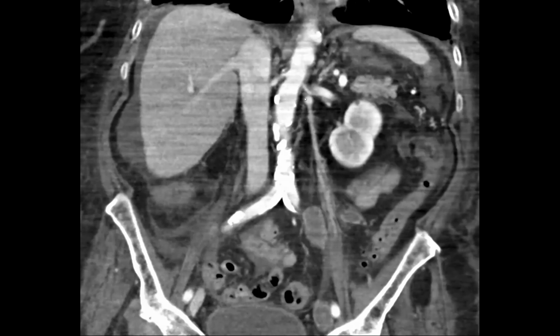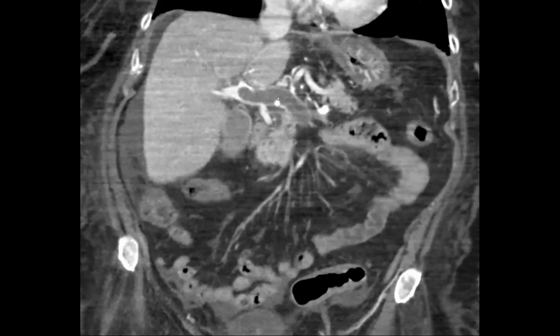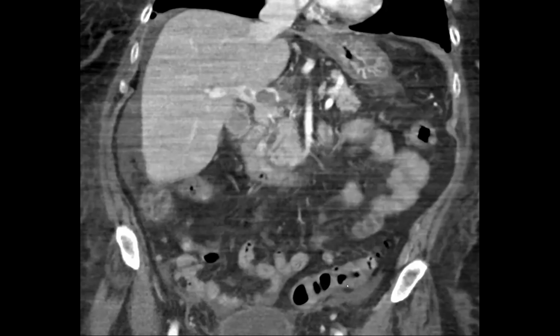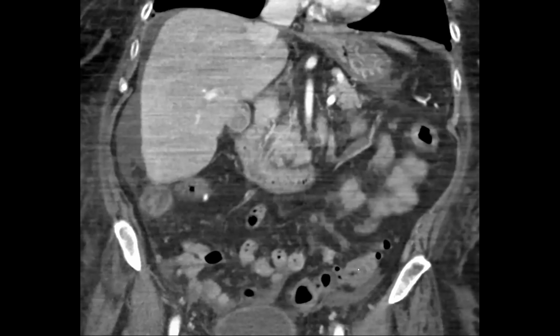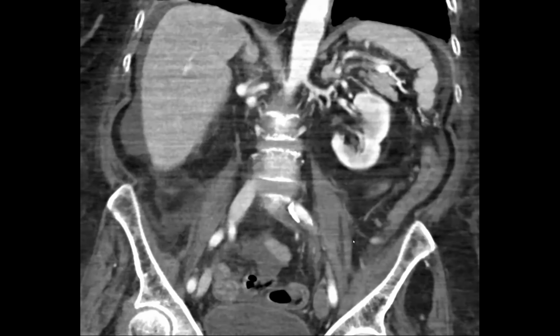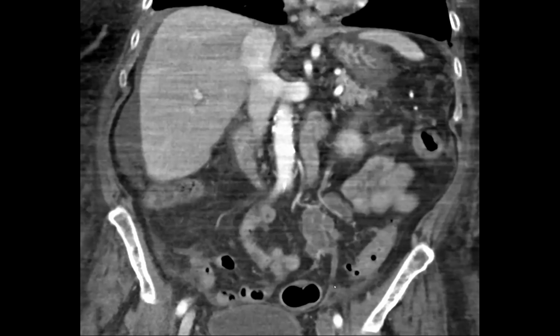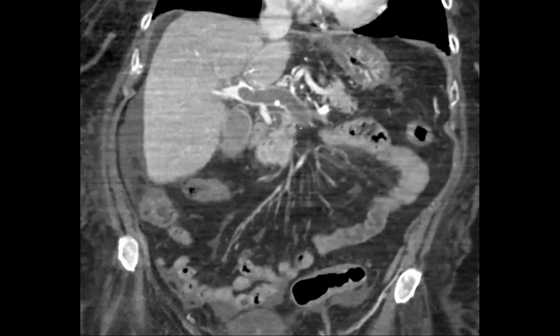That's also extending up into the main portal vein pretty extensively, and likely from an episode of diverticulitis. That's usually where these come from. You can see there are lots of diverticula here. We can't really see an acute diverticulitis right now, but it could have been from that or maybe even colitis from this area. We thought it was probably from a prior diverticulitis. Just a nice case of septic thrombophlebitis, and when it's involving the portal vein, it's called pylephlebitis.